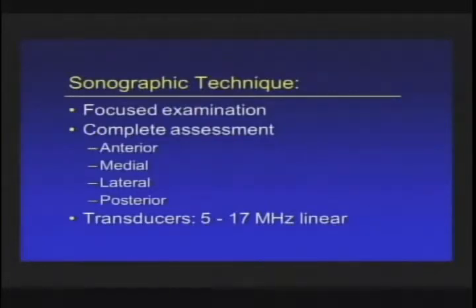At our institution, we prefer a more comprehensive evaluation. Every knee patient who comes in for an ultrasound is imaged the same way, anterior, medial, lateral to posterior, so that as a radiologist, I know the imaging sequence that the technologist will save for me, and when I go in to scan, I would do the same thing. What's nice about that is my technique, I get to practice that.